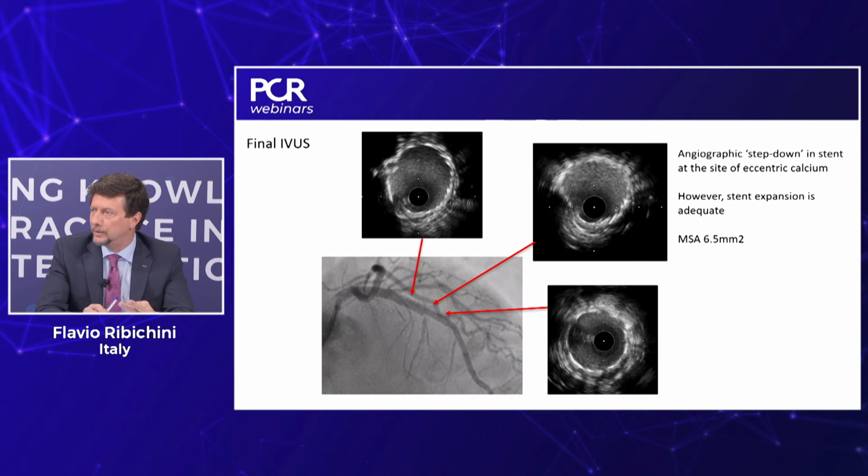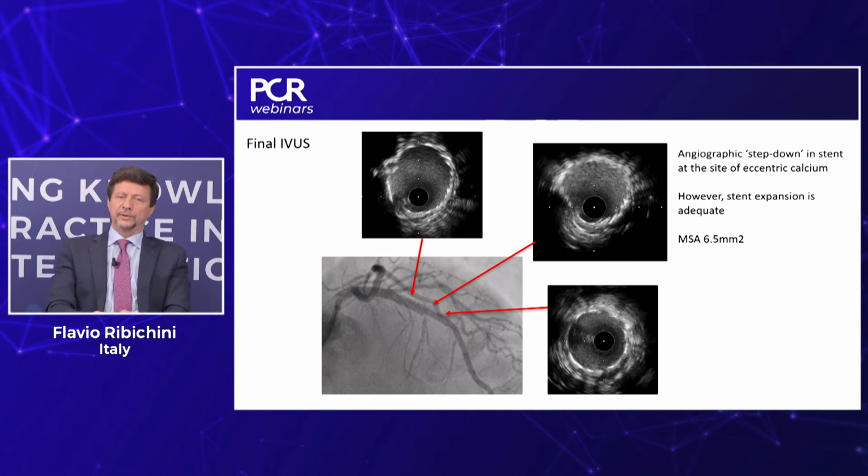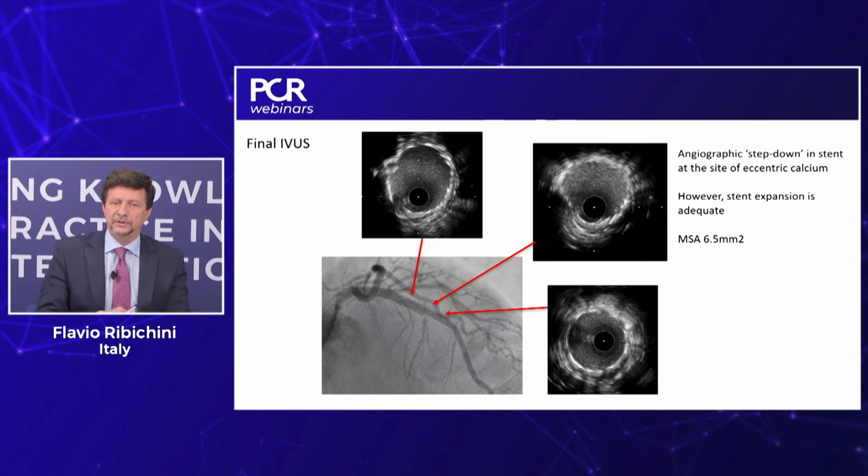Calcium is a stone. So you can make fractures, you can push it a little bit, but if you push it too much, it will break the artery wall. So it's always a trade-off between efficacy and safety. And of course, working at low pressure with the IVL balloon makes this much simpler and safer than going with a 4.0 at 30 atmospheres to get what? To get 7 square millimeters, and you have the risk of breaking the artery wall and having tamponade and complications. So I think it's very wise to stop at a certain point after you get an acceptable result.